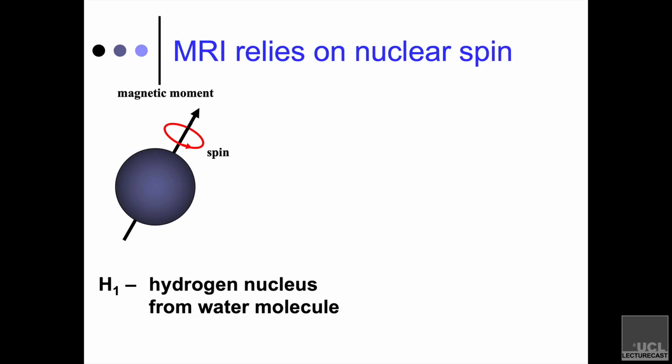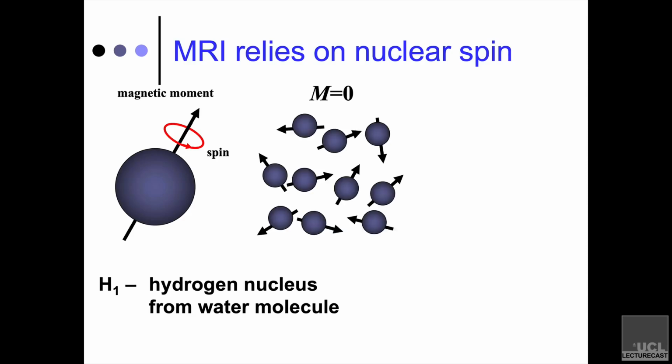Because something like 60 or 70% of your body is made out of water, there's a ton of these free hydrogen nuclei running around your body. It's probably the most common single element in your body. And that's really useful because we can use the spin property in magnetic fields.